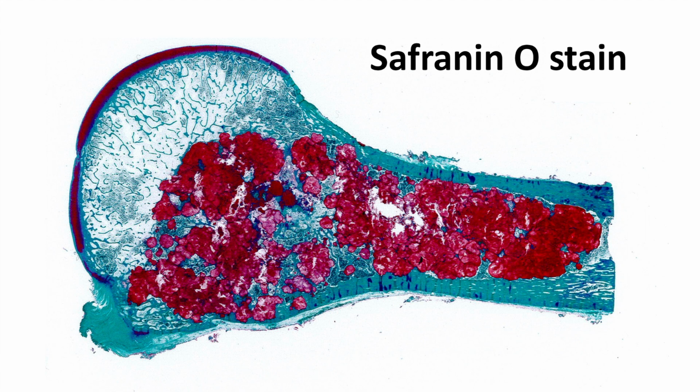I've scanned the glass slide on a scanner so you can see the whole thing, but the actual size of the glass slide is about 10 centimeters long by 8 centimeters wide. Compare that to a regular glass slide that pathologists normally look at for routine specimens, which are about 7.5 by 2.5 centimeters.